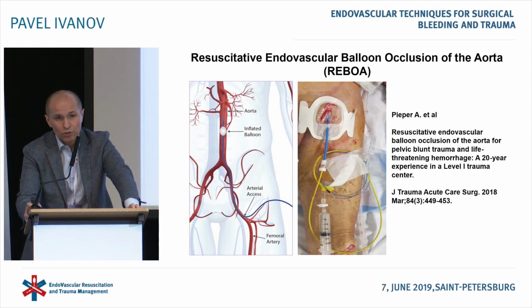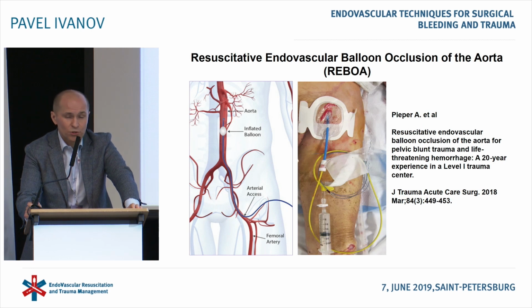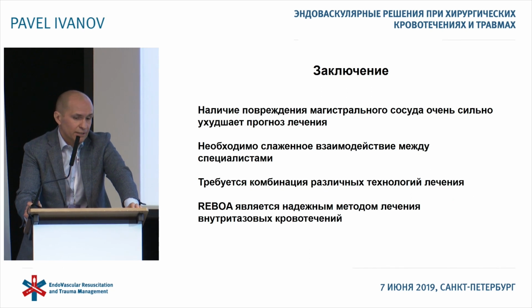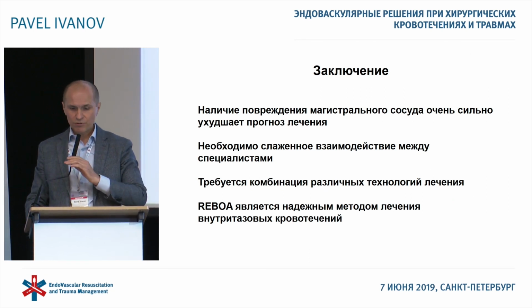Aortic occlusion, the resuscitative endovascular balloon occlusion technique, is very efficient, and it should become a practice in our country too.